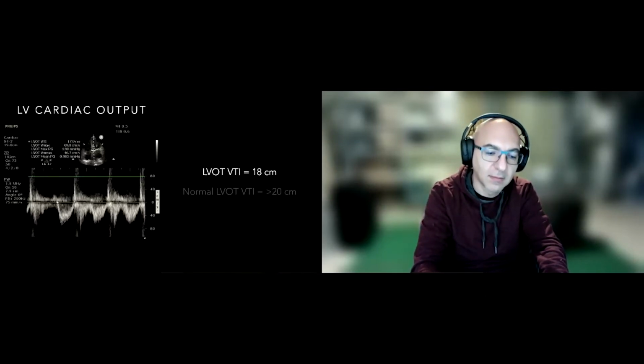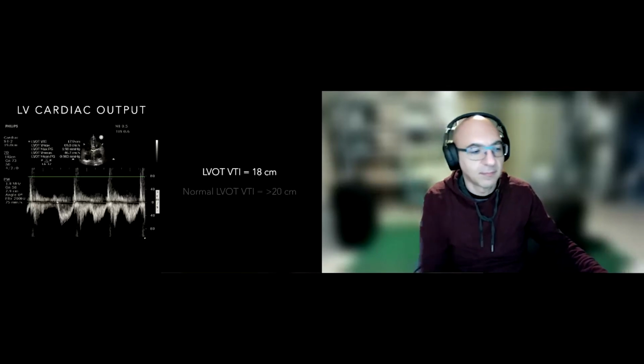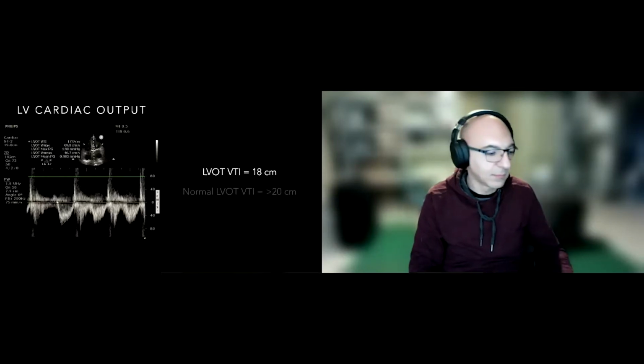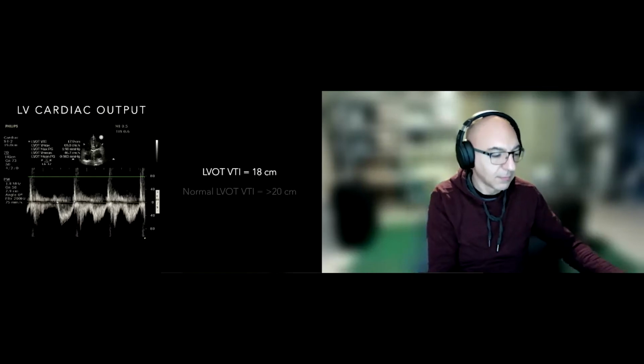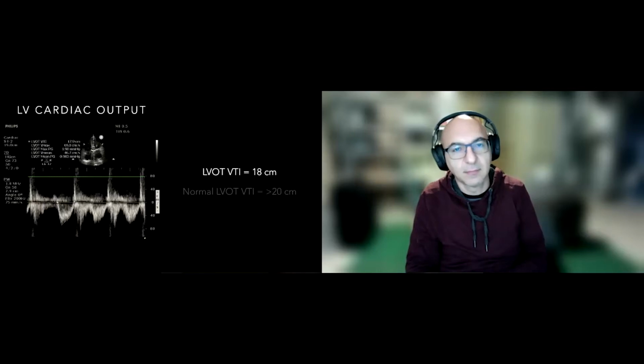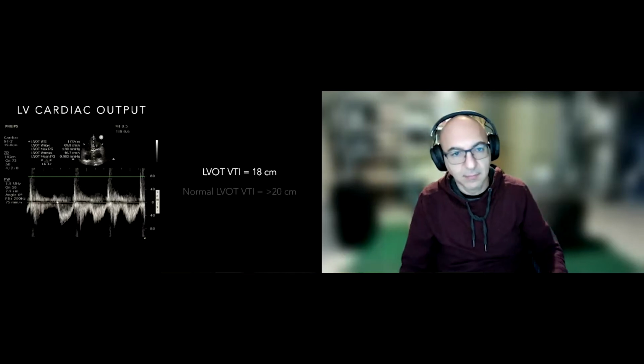Even extrapolating it to the surgical ICU, where a lot of the problems we see are volume issues that translate to looking at the heart, and we typically see a hyperdynamic EF that's just got terrible preload, whether it is insane amounts of insensible losses or immediately post-op and poorly resuscitated. So thank you for bringing that etiology up, since that's probably what we see most frequently in surgery.